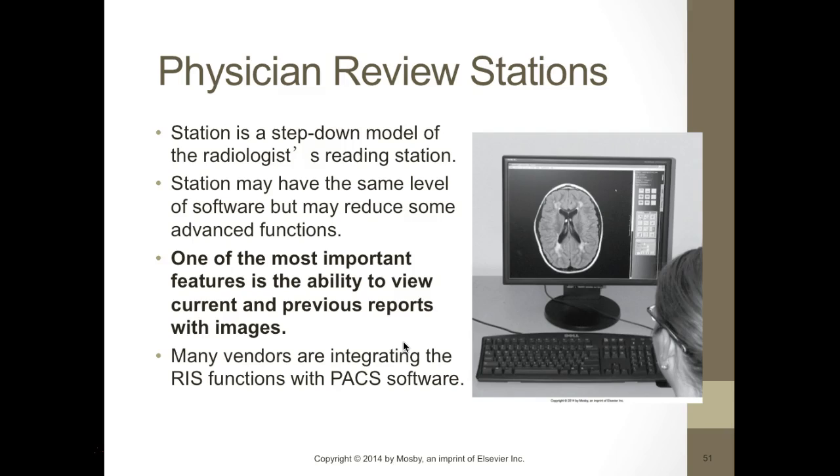So the physician review station, so is a step-down model of the radiologist reading station. So stations may have the same level of software, but may reduce some advanced functions. So when physicians come in to look at images, we typically don't give them all the bells and whistles that a radiologist has. And sometimes they have the same stuff that we do, but we'll even take some of that off. We don't want them changing or manipulating the image.